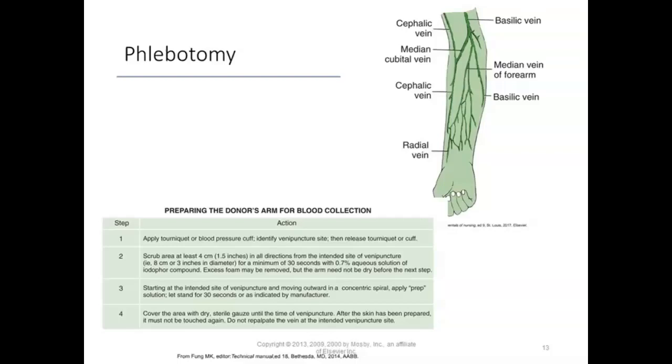So yeah, you're in a reclining position, so your feet are elevated a little bit. In the event that a person does start having symptoms or dizziness, that chair is movable, so they can set it up to where your feet are even higher and even more above your heart.